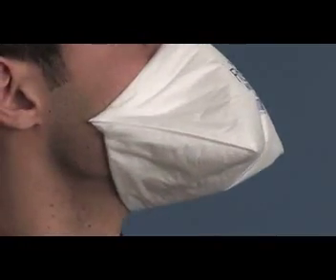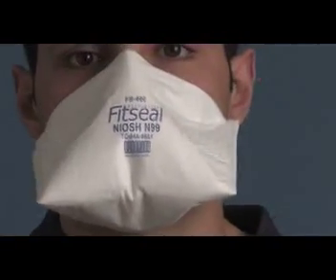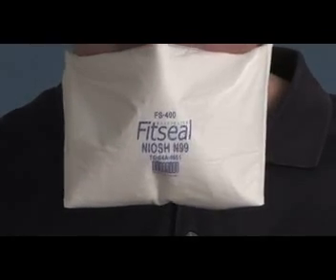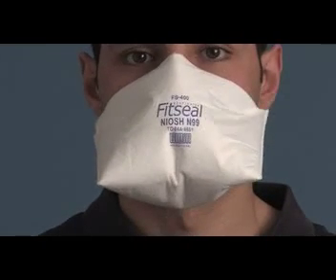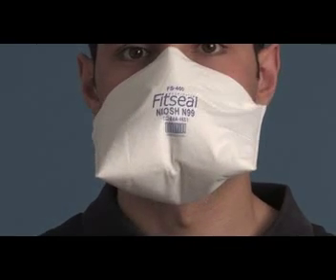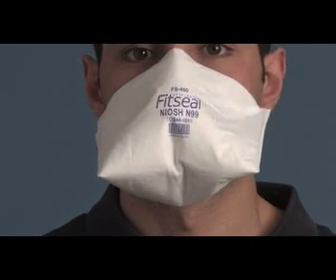Once the FitSeal respirator has been applied, a user seal check should be performed to ensure there are no leaks and a secure face-to-respirator seal has been achieved. This is done by breathing in and out forcefully. You will notice that the top layer of the respirator will billow out slightly on exhalation and collapse inward on inhalation. If a leak is detected, apply more pressure to the area to seal the leak.